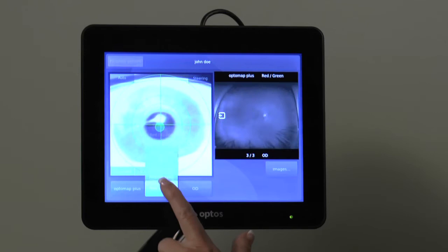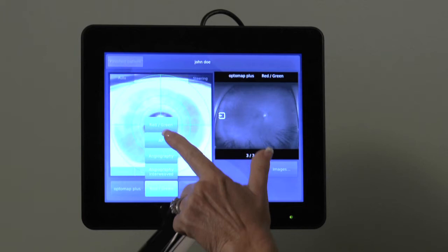Selecting the middle tab on the lower portion of the screen will allow you to switch between red-green, autofluorescence, angiography, and angiography interweaved. We will now capture an autofluorescent image of the right eye.